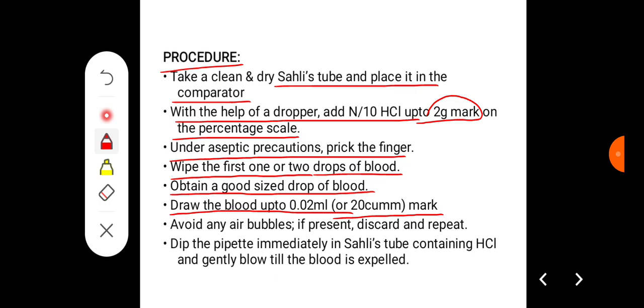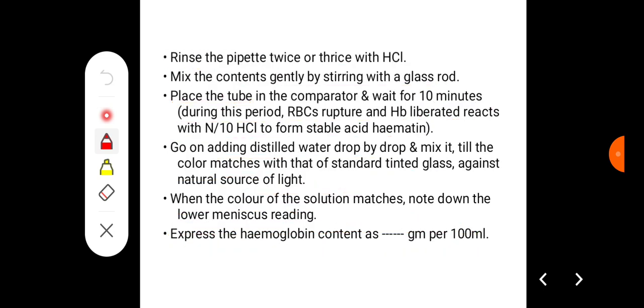Draw the blood up to the mark of 0.02 ml, that is 20 cubic millimeter mark, in the hemoglobin pipette. Avoid any air bubbles; if present, discard and repeat the procedure. Dip the pipette immediately in Sahli tube containing HCl and gently blow till the blood is expelled. Then rinse the pipette twice or thrice in the HCl.